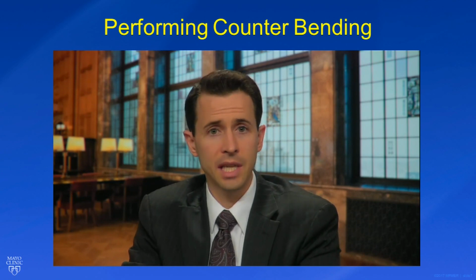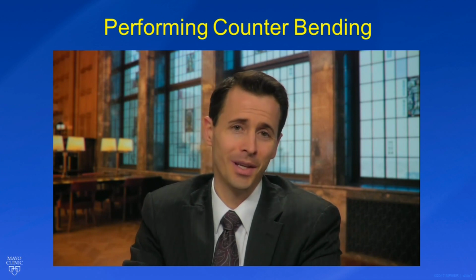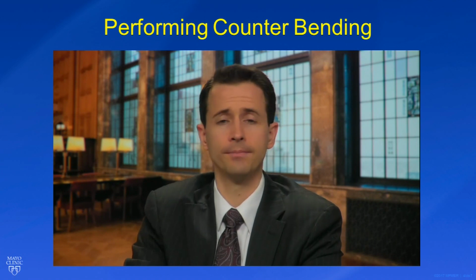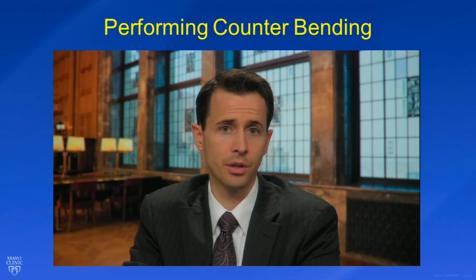Now, if after all of these steps you still find you're unable to get to the third or fourth positions, just be patient. Most men will only be able to get to position 1 or 2 during the first few weeks of traction. Once the penis is sufficiently stretched, you should be able to get to position 3 or 4.